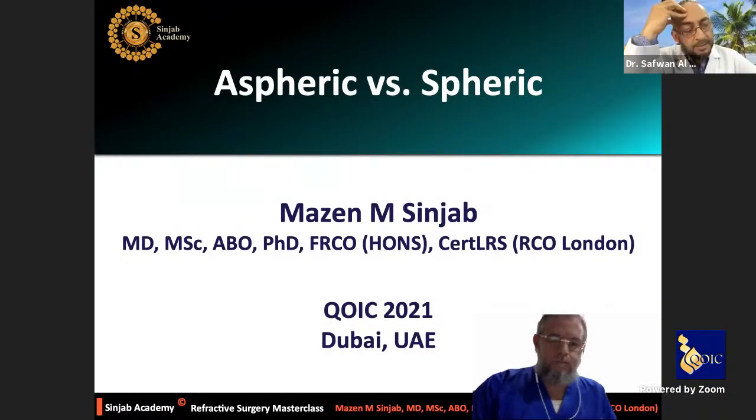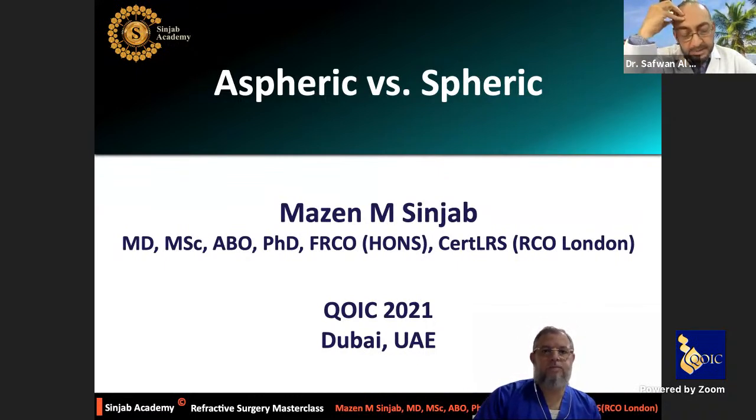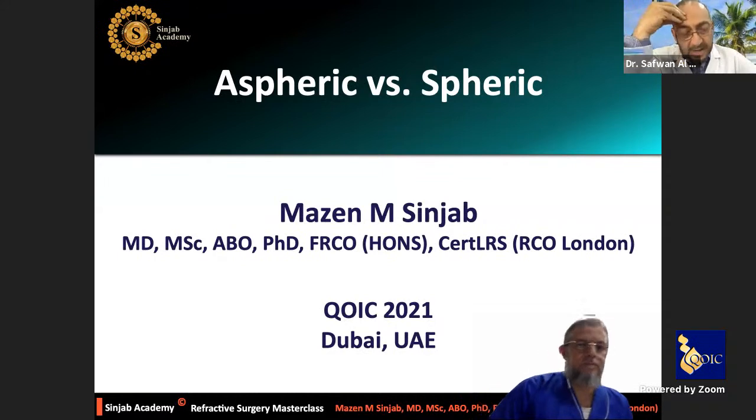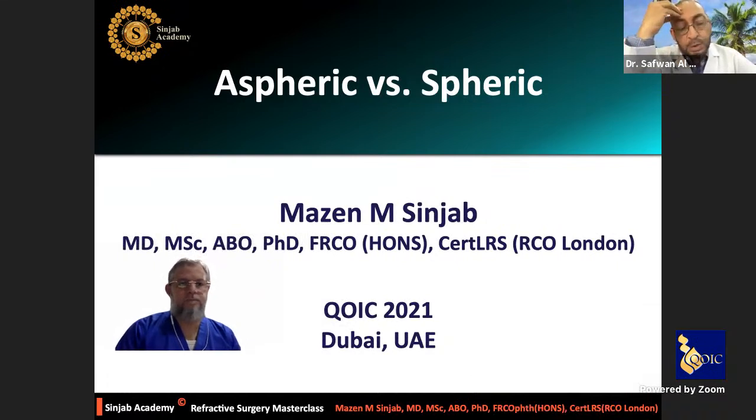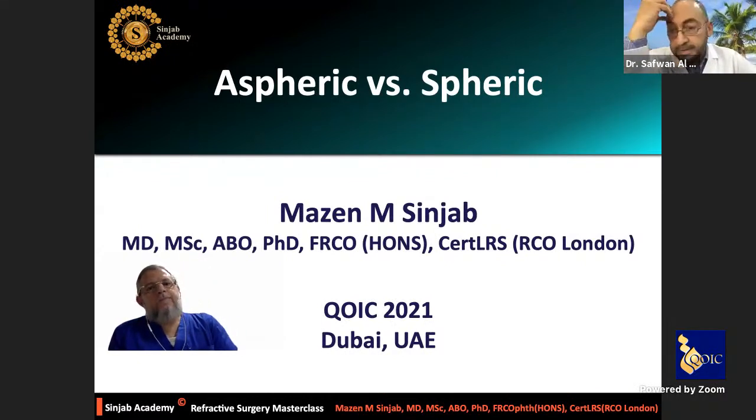So great, thanks to you. Finally, just 2 minutes to mention some things, because it's important. The K reading that you mentioned, the K reading from total power, if we are using it, we did a comparative study between the IOL Master 700 and the use of the total K reading as the K for the Barrett toric. We found that using the total K reading in the Barrett toric is more accurate than the IOL Master 700. So great thanks to you and for your points, and for the points on the axis, because it's very important, especially in young patients. I'm not using it and I'm not following it.